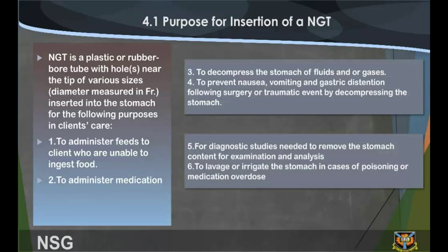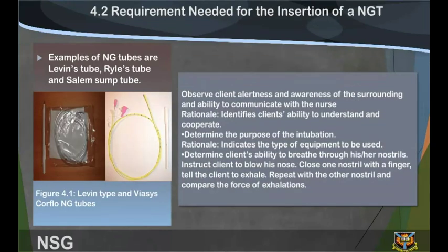4. To prevent nausea, vomiting, gastric distension following surgery or traumatic event by decompressing the stomach. 5. For diagnostic studies, needed to remove the stomach content for examination and analysis. 6. To lavage or irrigate the stomach in cases of poisoning or medication overdose.